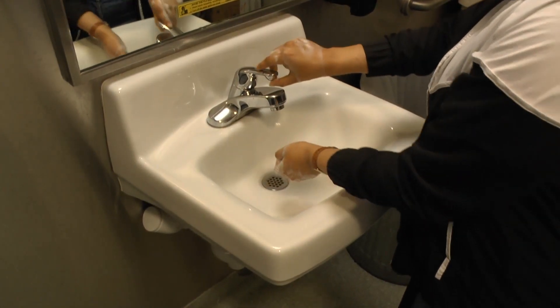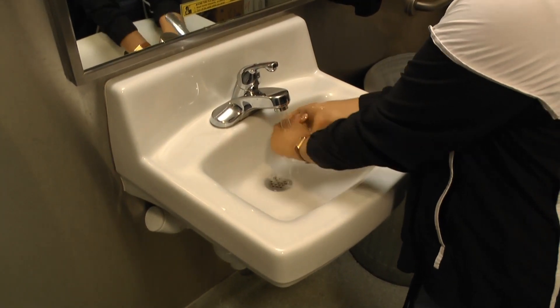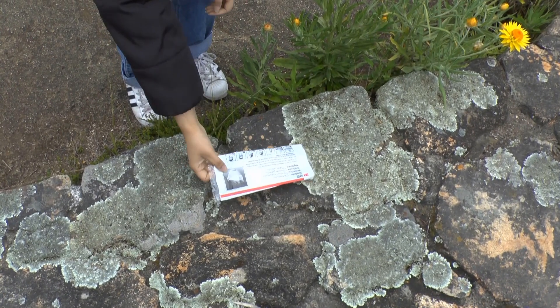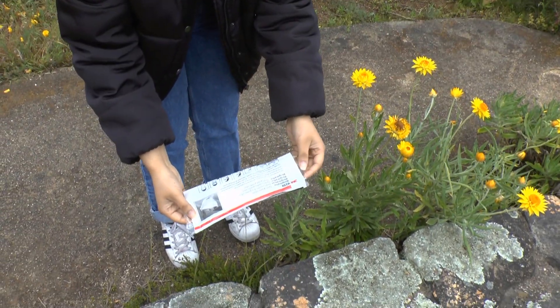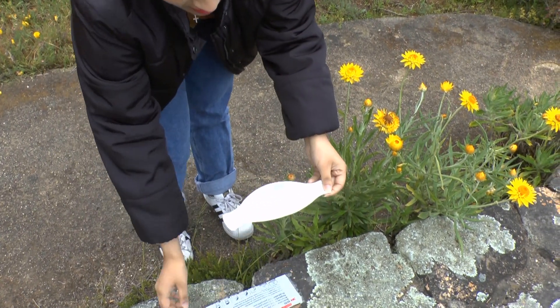Begin by washing your hands with soap and water before removing your respirator from the package. With a packaged folded mask, first remove it from the packaging and then carefully unfold it until it is completely open.